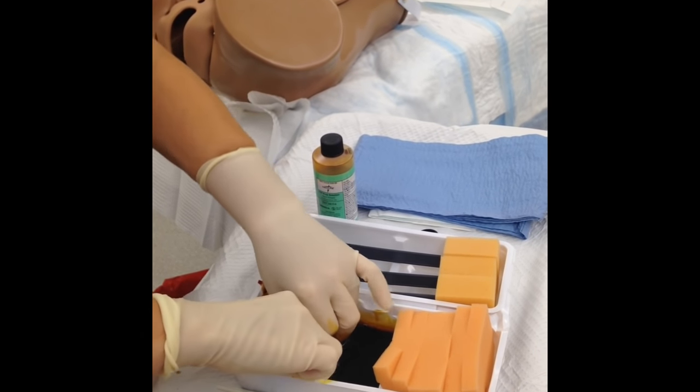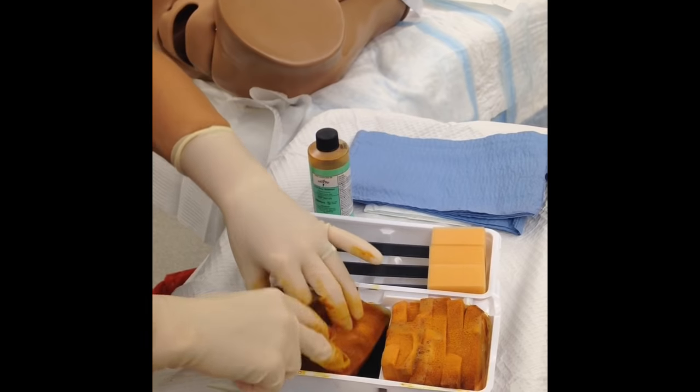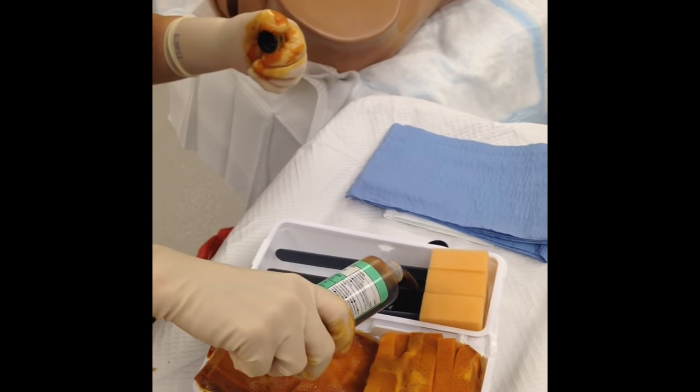Now I'm going to go ahead and pour my scrub over my sponges. I'm saturating them. We're going to use all six of these during our prep today. Then we're going to use the solution on the prep sticks themselves.